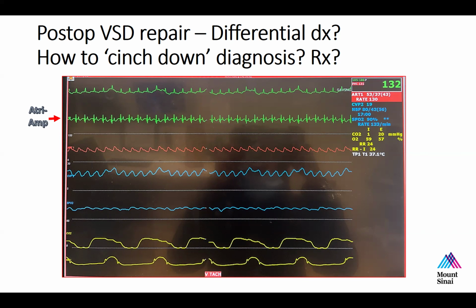Yes, you could do a 12-lead EKG. I'm going to give everybody a hint. The answer, get a 12-lead EKG, is never the wrong answer. You can get 100% credit for every question I ever ask about what the next best test is. A 12-lead EKG will almost always be the right answer. So yes, you can get a 12-lead. Now, how would the 12-lead help you? Would you be able to tell if there was a bundle branch block better with the 12-lead?